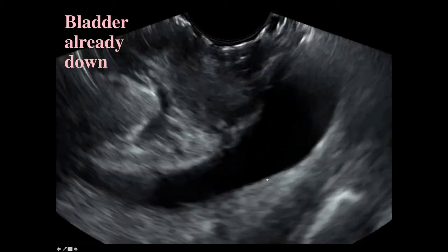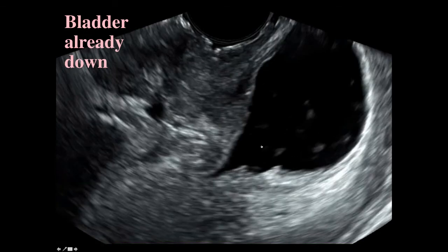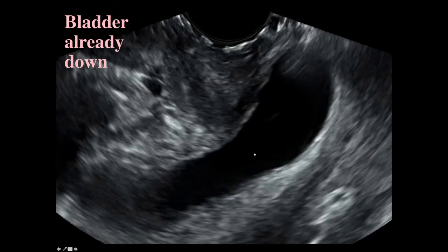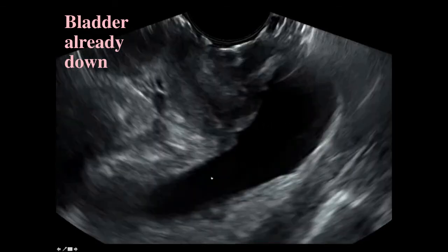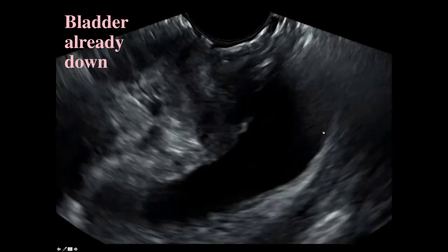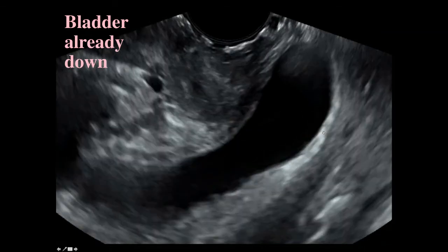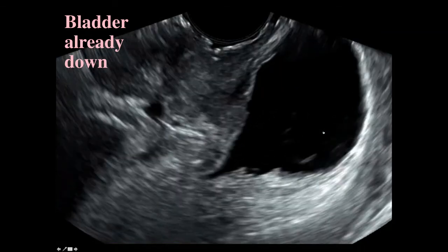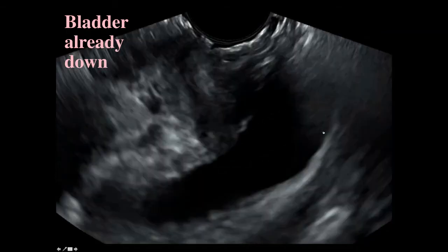So she's going to Valsalva, and the whole thing goes down, and you can see that things really clamp shut here so that she can't possibly empty the rest of her bladder. And so she will always have that amount in her bladder even after she voids. And not only that, but she'll have a bulge that will be attempting to come out her vagina.